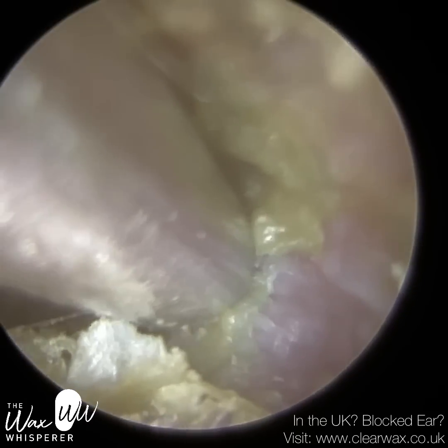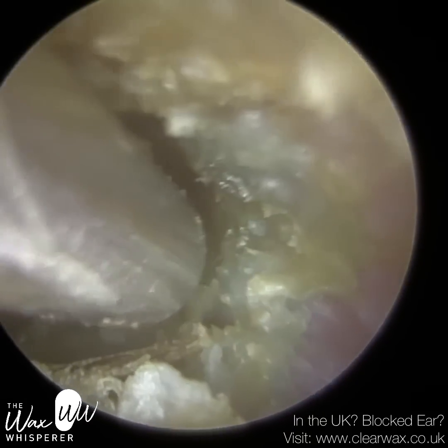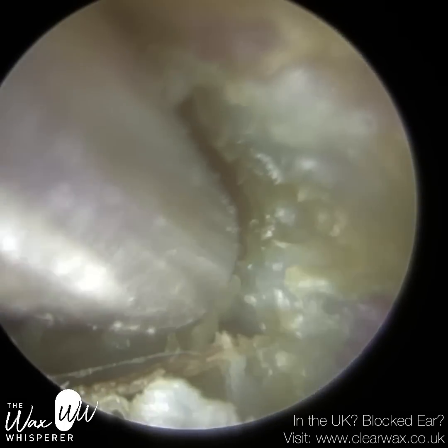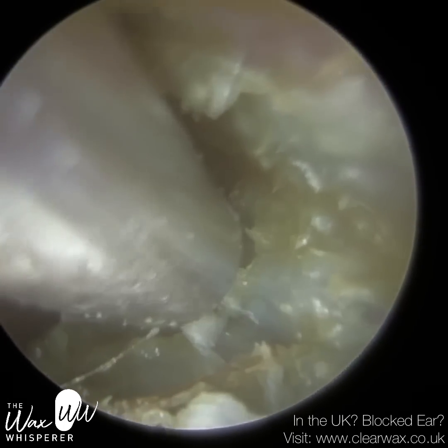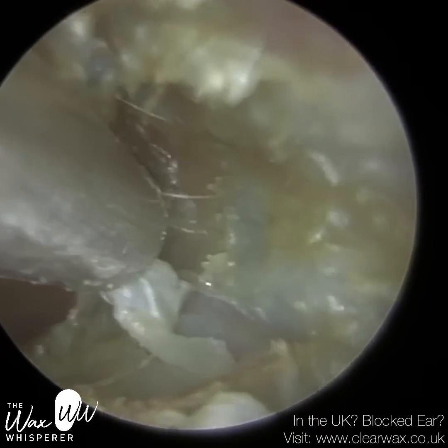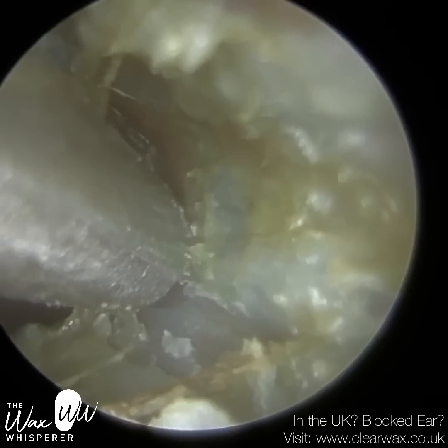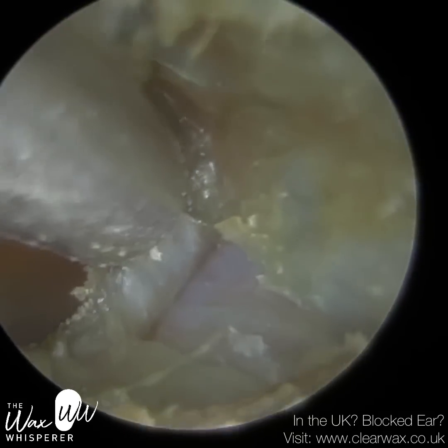You may think that the ear canal is clear because you can visualise it. However, if you stay tuned, the eardrum itself has got a thick layer of dead skin. I'm going to spend the best part of 10 to 15 minutes trying to remove that — it was really quite complex. To the naked eye it appeared okay, but when I eventually managed to remove the crusted dead skin off the eardrum, the patient can hear significantly better.